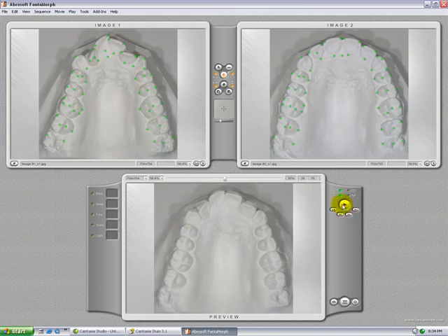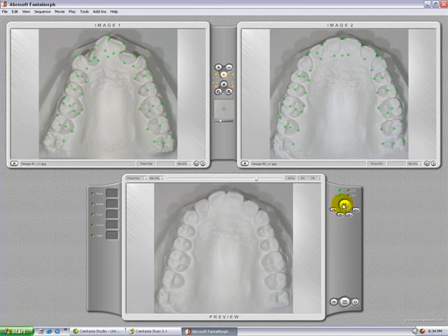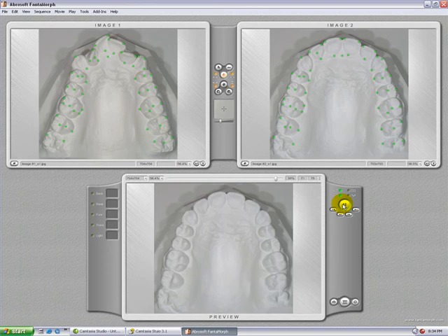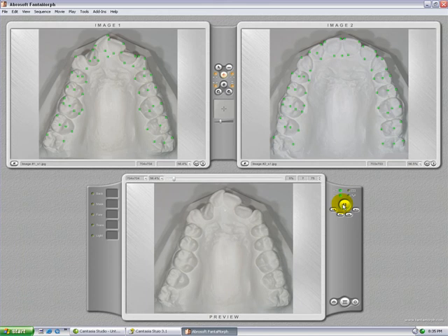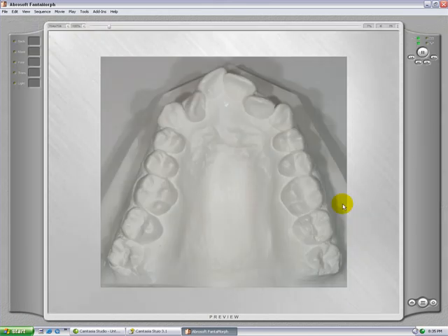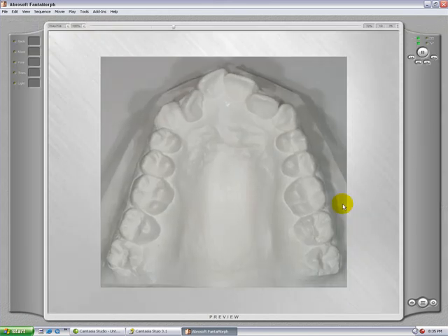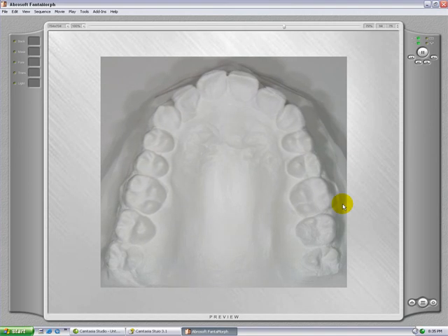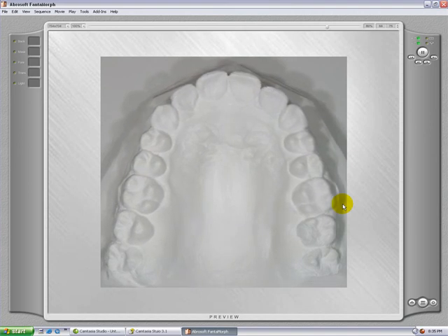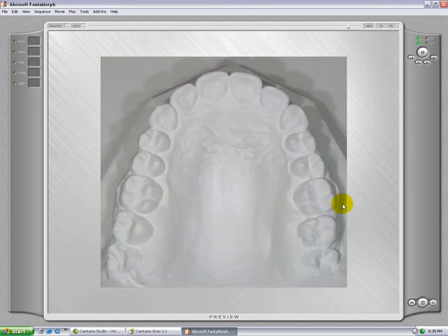Let's see the end product by clicking on play. Now we can see the morph from the beginning model to the after model. To have a better preview, click on F7.